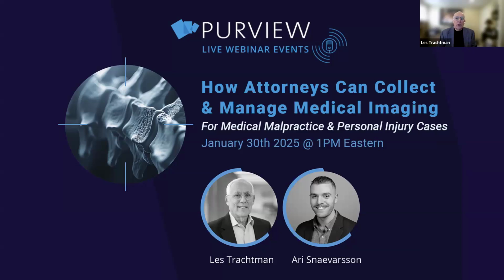When you're involved in litigation for personal injury or medical malpractice or similar types of litigation, it's really good to be able to tell a real story, and if you can tell that story in living color, in true medical imagery, it's much more compelling, both in terms of your ability to settle a case, but it's also compelling when you show that to a jury. So using real, as we call it, raw medical imaging, the same as a physician would review themselves to do a procedure or to review a procedure, is very compelling.